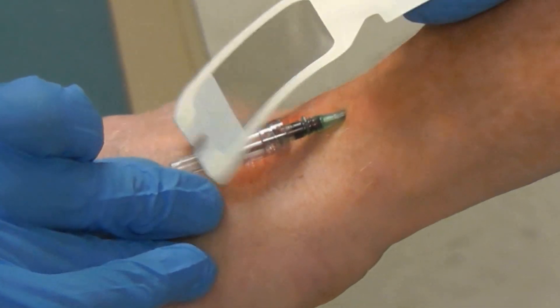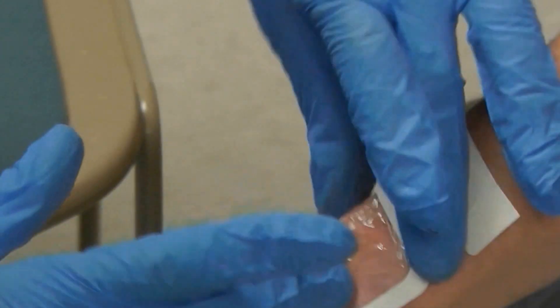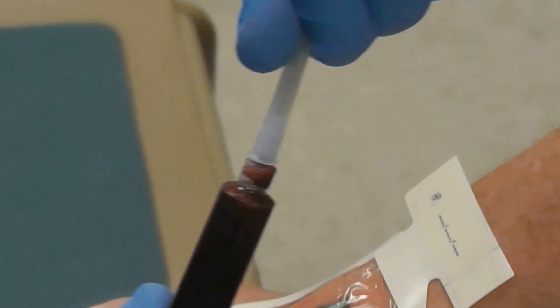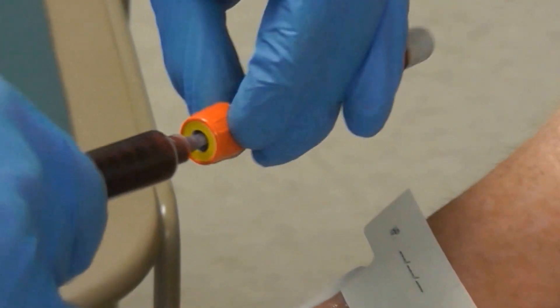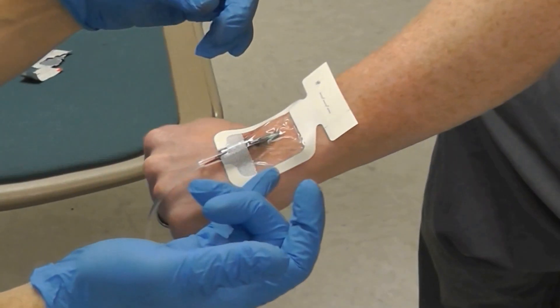I kind of got to be quick with this because I don't want that blood to clot in that syringe. So now that I've got my blood sample here, I'm going to go ahead and put a needle on. Be careful not to stick myself. We now have a sample for labs, and we have our IV that I'm going to be able to secure in.